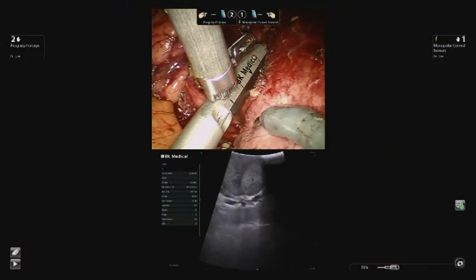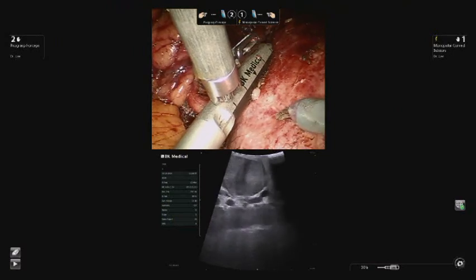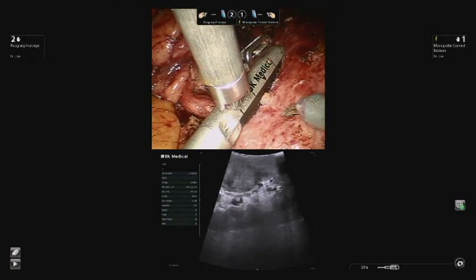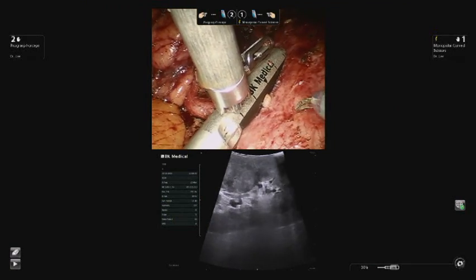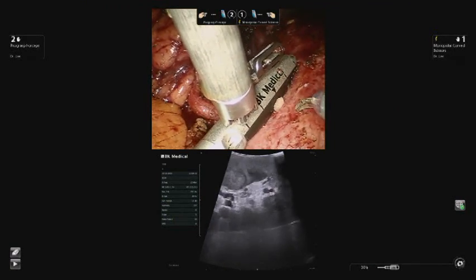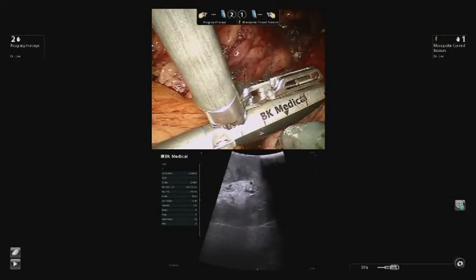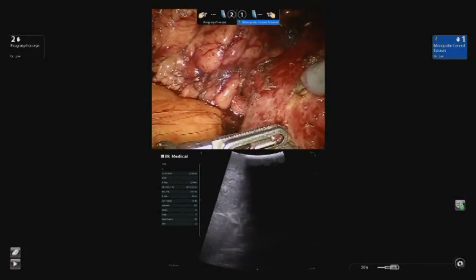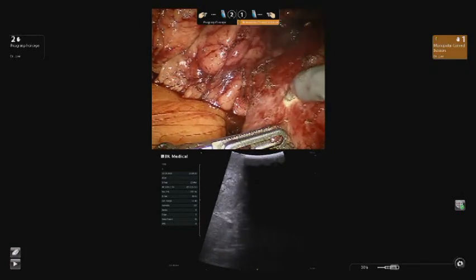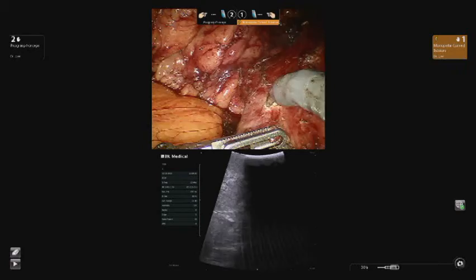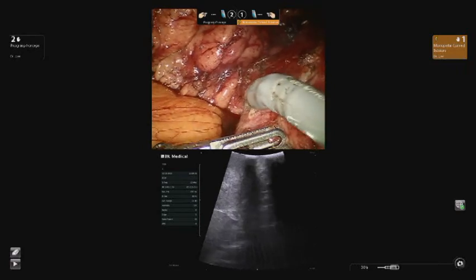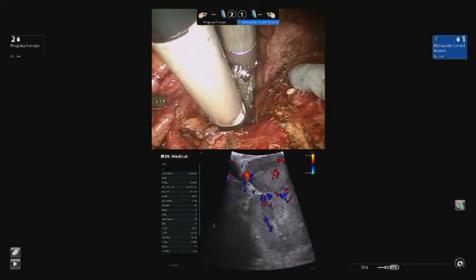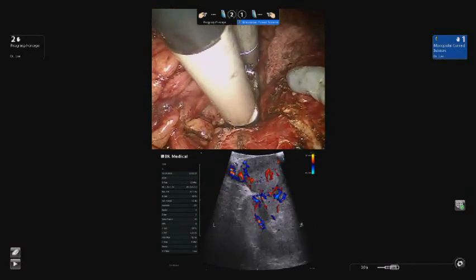Intraoperative robotic-controlled ultrasound is used to help localize the mass, assess proximity to the collecting system, and delineate surgical margins prior to extirpation. The renal capsule is scored circumferentially, creating a groove prior to excision of the mass.